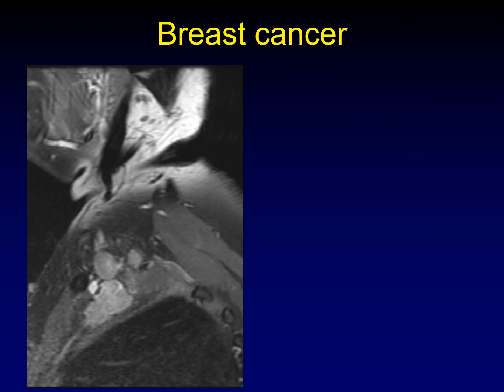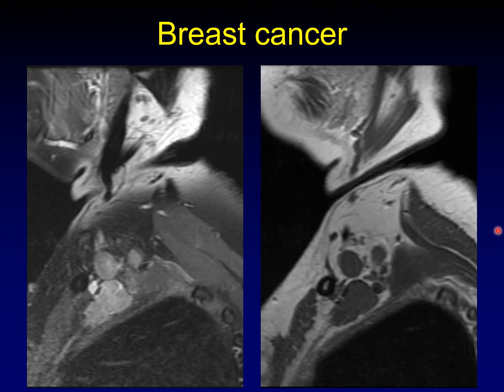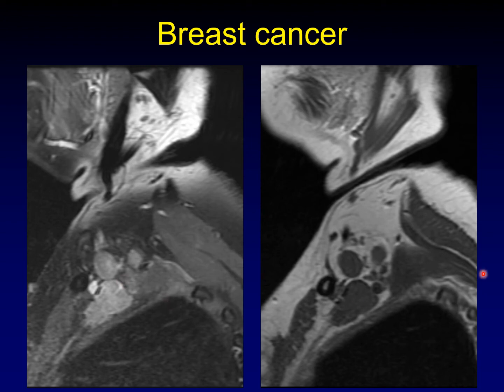Breast cancer is famous for affecting the brachial plexus because it metastasizes to axillary and supraclavicular lymph nodes right near the brachial plexus. On a post-contrast image you can see some large nodes, but to find the brachial plexus itself, the unenhanced T1-weighted image comes to the rescue. You can see the subclavian artery and all the nerves of the brachial plexus and their exact anatomic location. Going back to the post-contrast image, you can see abnormal enhancement — there is actually infiltration of the brachial plexus by metastatic disease.